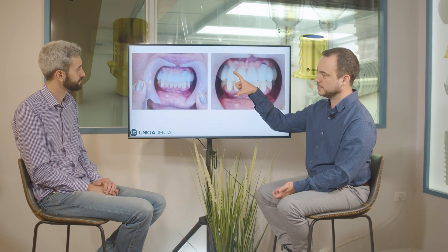This was probably the final version of the teeth. You can see that we made the teeth look a little bit higher and even a little bit wider. You can also see that this multi-unit is visible because it's an angled multi-unit — with angled multi-units in many cases you have a buccal bulge. In the buccal part of the multi-unit you will see it, but it's very high, much higher than her smile line, so you won't see it when she smiles.